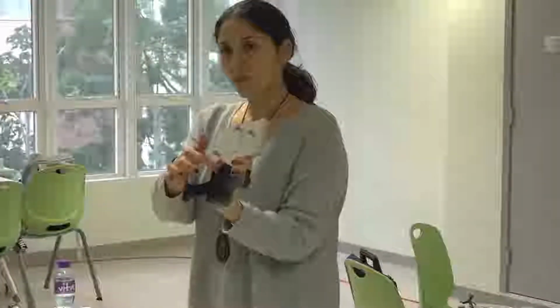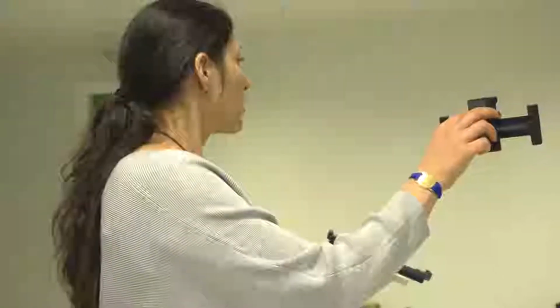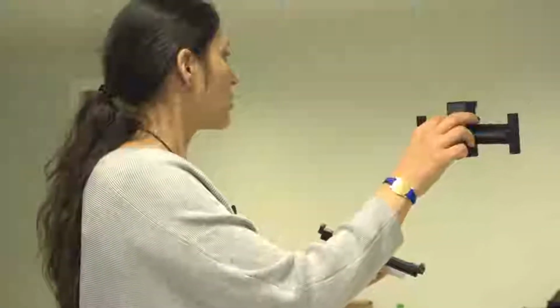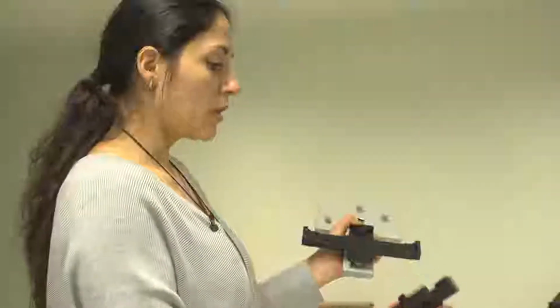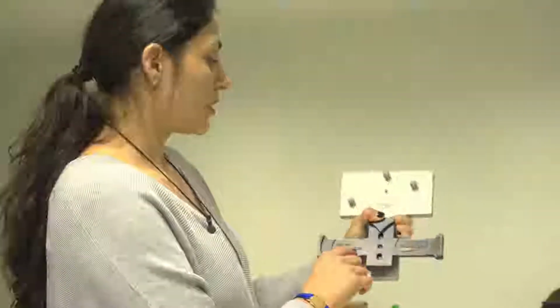So once again, the coils are different. Okay, so this is for the cool coil. So which sign should we read? It says here cool. Oh, there's a cool there. So this is the one I'm going to use, right?